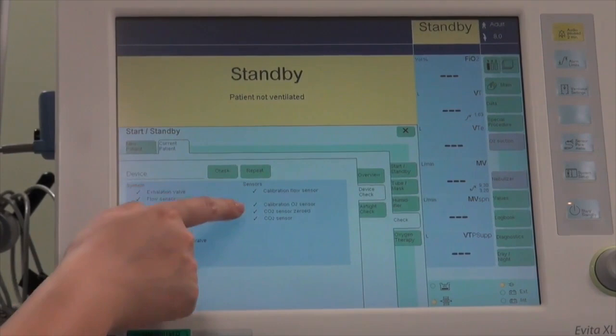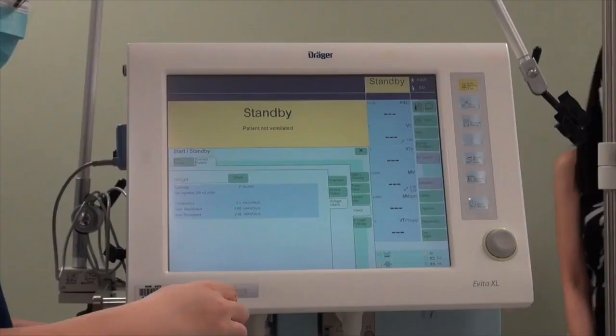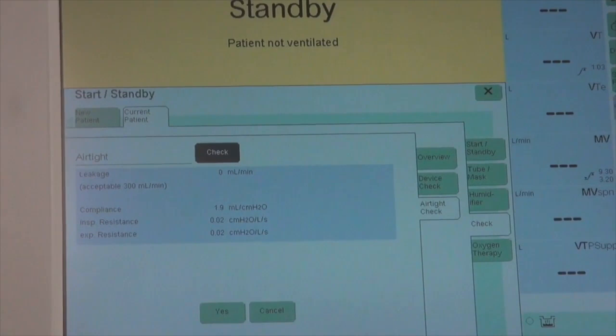Now that all device checks have been done, we need to go to the airtight check. For the airtight check, connect it to the Y-piece. Seal the Y-piece and confirm with Yes, then keep the Y-piece open and confirm with Yes.